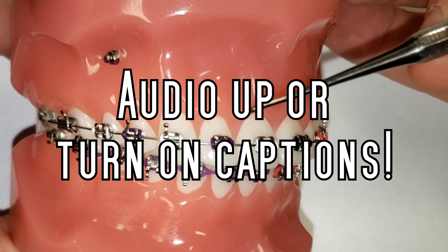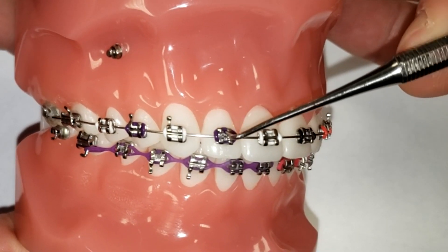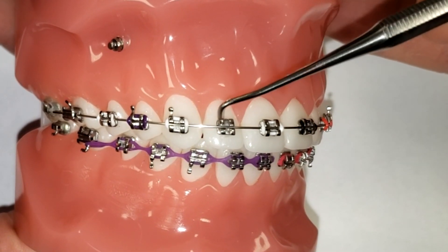Hey guys, this is The Crazy Orthodontist here to show you what it looks like whenever one of your colors or your power chain pops off and what to do about it. So first off, I'm going to take this color off right here — this purple — and just kind of set it down. This right here is what it looks like whenever there's no color on there.